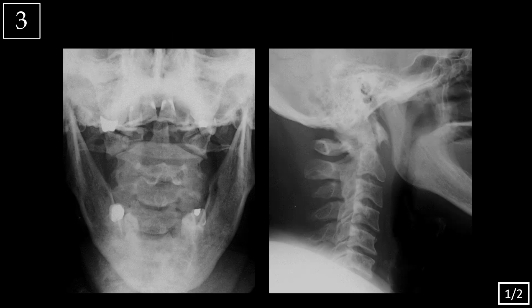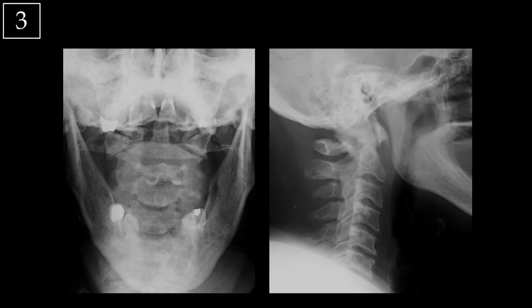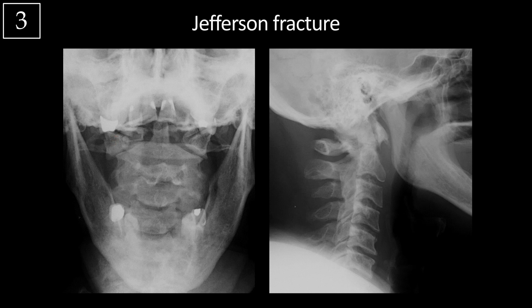Case three. We're looking at a frontal odontoid view of the cervical spine and a lateral view. On the odontoid view, notice how the lateral mass of C1 is displaced laterally relative to the C2 lateral mass. The dens looks intact, but there's disruption of C1, and this is consistent with a Jefferson fracture.